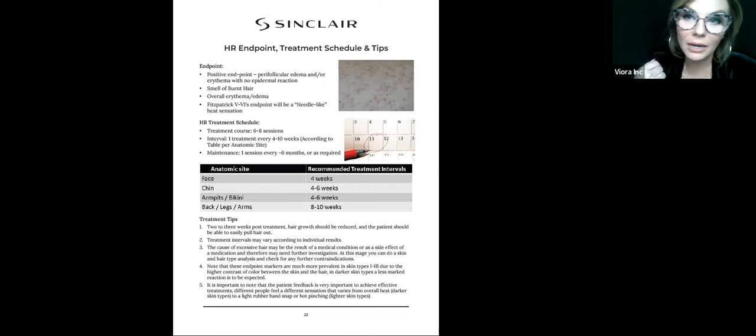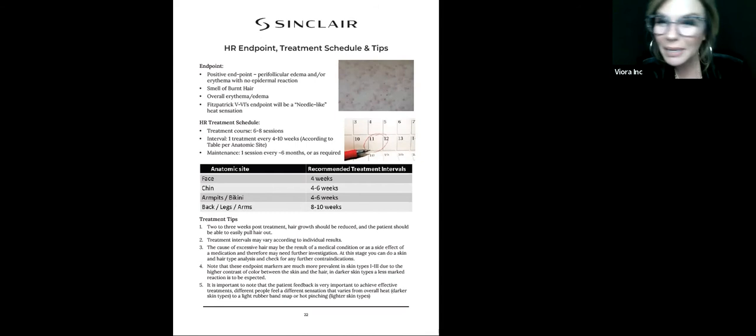Your treatment course is going to be about 6 to 8 sessions. I would say most everyone is about 6 sessions. Unless you have a full man's back that's really dark and dense and coarse, and you need to use Dynamic in the beginning, and you're going to go a little bit slower on them. Not that Dynamic is going to be less effective, because that's not true. It will be just as effective. Maybe you're going to go slower on them, maybe you're not turning up energy much, maybe they're nervous, whatever it may be. Then you can always sell a pack of add-on sessions.